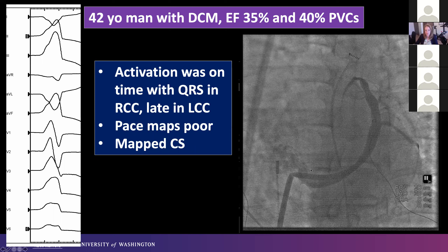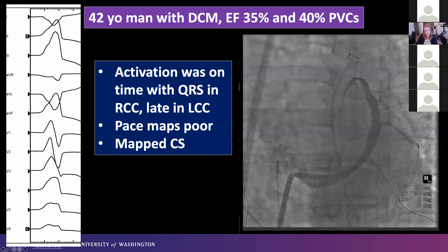The pace maps in that whole region were poor. So I went ahead and mapped the coronary sinus. This image shows an Agilis catheter kinked at the ostium of the coronary sinus, which happens more than I'd like. I delivered it into the coronary sinus and injected contrast through it — you can also inject through the ablation catheter itself. I like to do this kind of image before aggressively mapping the more distal coronary sinus so I'm not overaggressive with how far back I push.